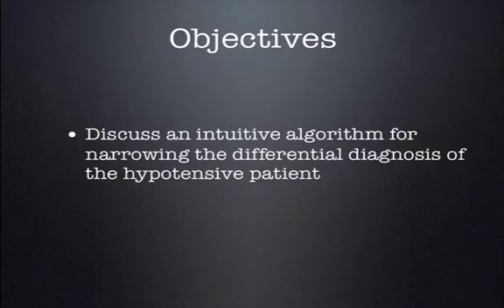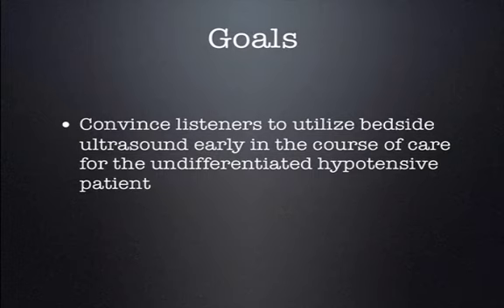The objectives, we're going to discuss an intuitive algorithm or an intuitive approach to ultrasounding the undifferentiated hypotensive patient. Hopefully I can convince you to pull ultrasound to the bedside early when you have that undifferentiated hypotensive patient before you.